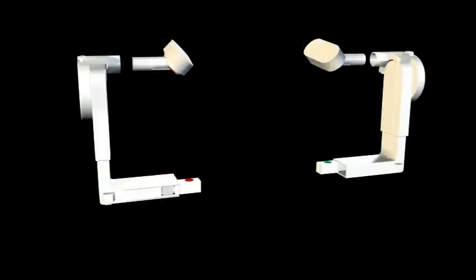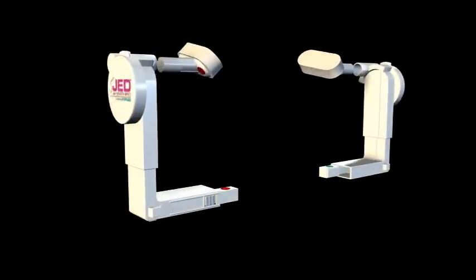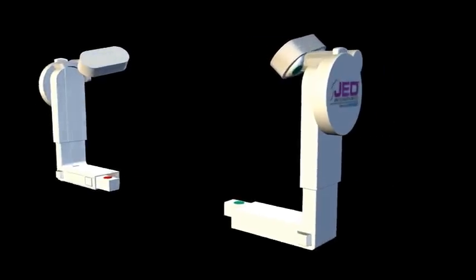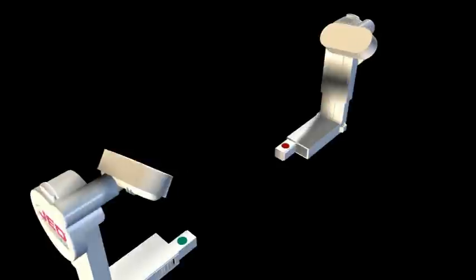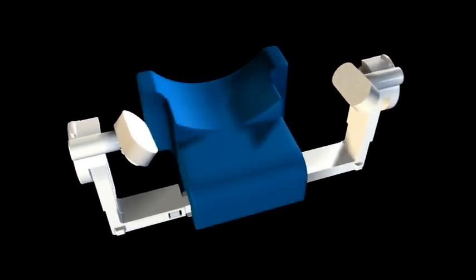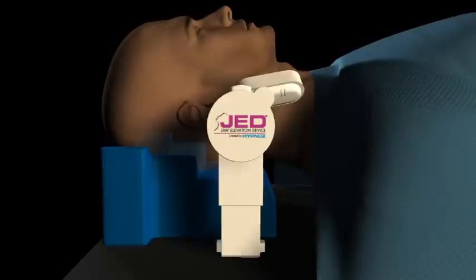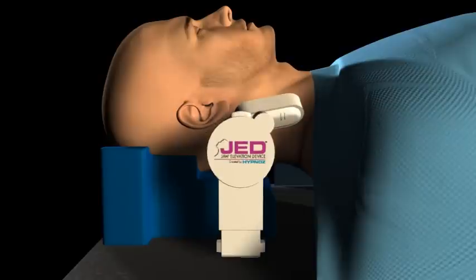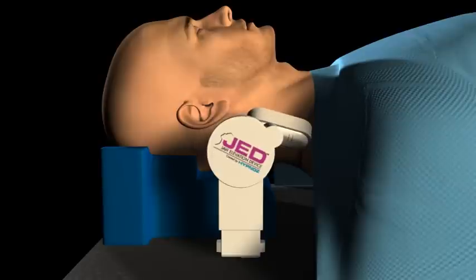Place the disposable mandible cups, marked green for right and red for left, into the reusable vertical support arms, also marked green for right and red for left. Slide both vertical support arms with disposable mandible cups part way into the base of the head support. Simultaneously, press and hold the button on top of each of the rotating knobs to slide the vertical support arms down to their lowest position, and then turn the rotating knobs forward so that the mandible cups are in the most forward position.